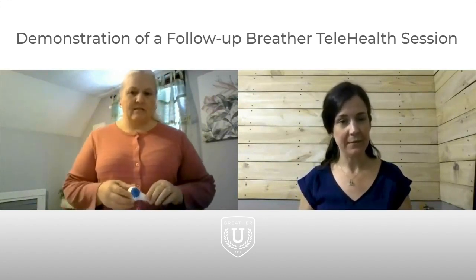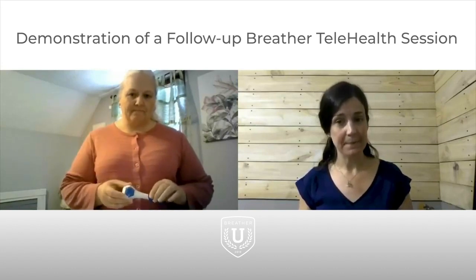I like the way you're using your resting hand to keep on your diaphragm. And right away when I said relax your shoulders, you went right back to good posture. So you're getting it. Good. So today, let's just do 5 at that setting. And then still twice a day? Yep. AM and PM.